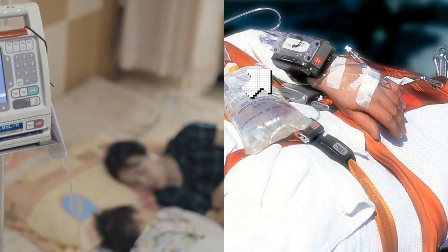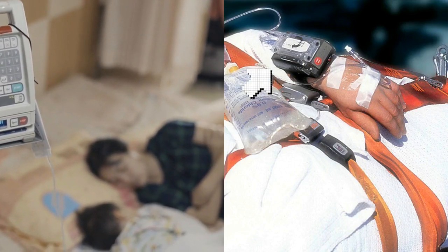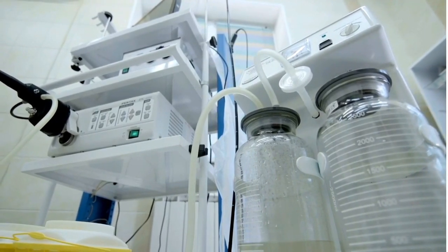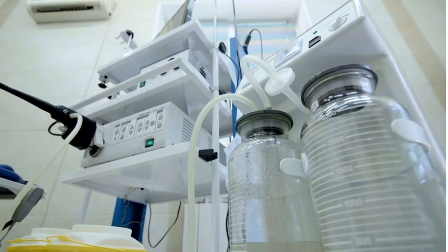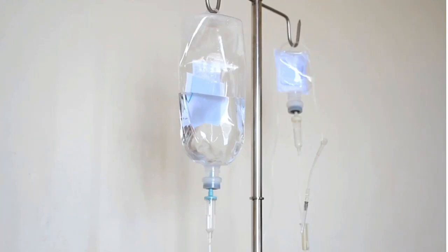Some infusion pumps are intended for usage at the patient's bedside only, for example. Ambulatory infusion pumps are meant to be portable or wearable. The rate of flow is controlled by an infusion pump which takes fluid from a typical bag of intravenous fluid. It delivers precise and ongoing therapy. An infusion pump may give fluids at either a very slow or very fast rate, since it can use any size of bag of intravenous fluid.